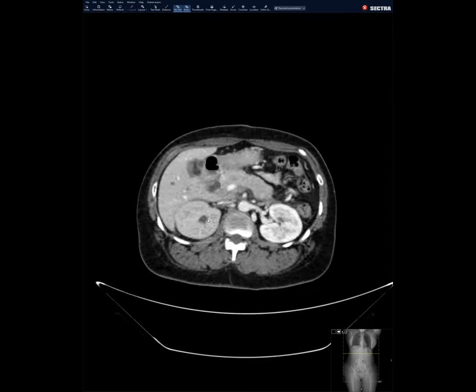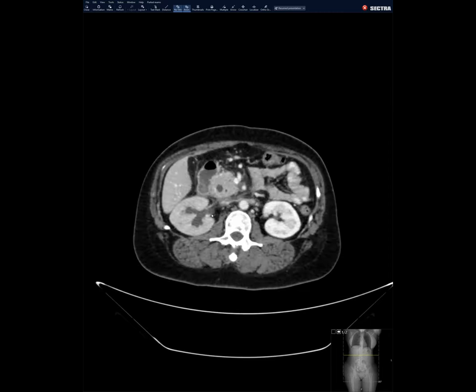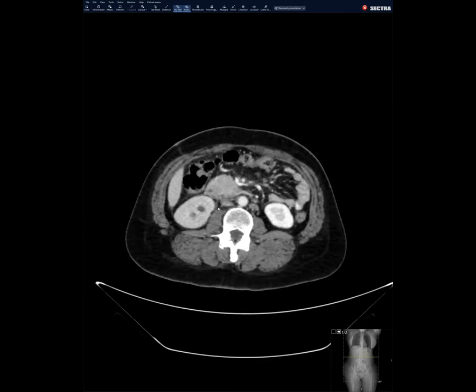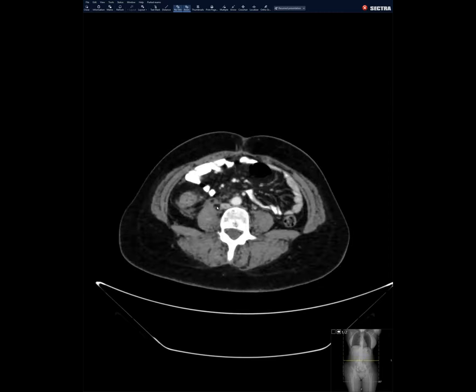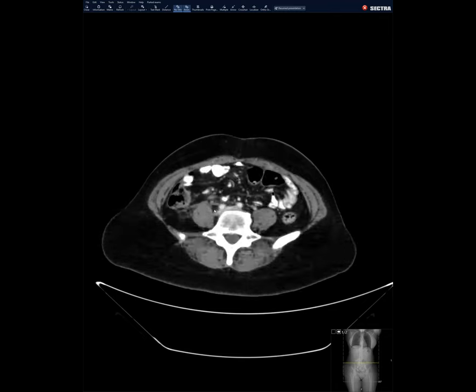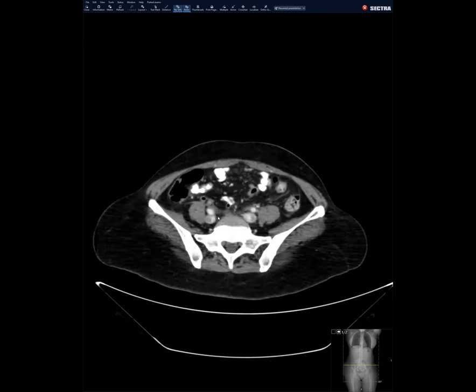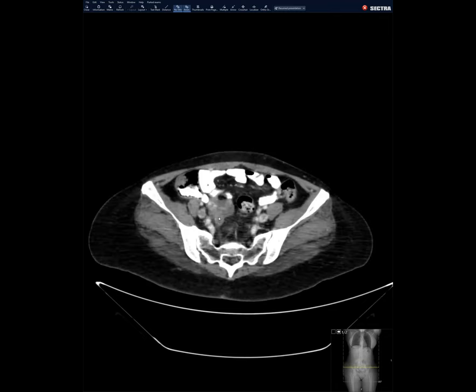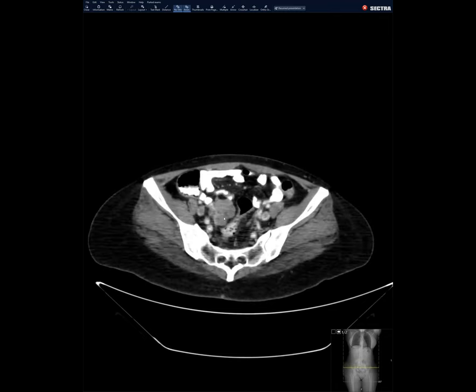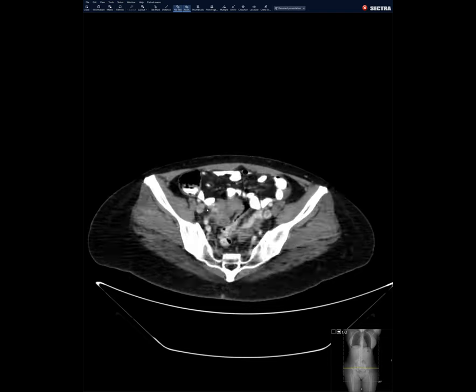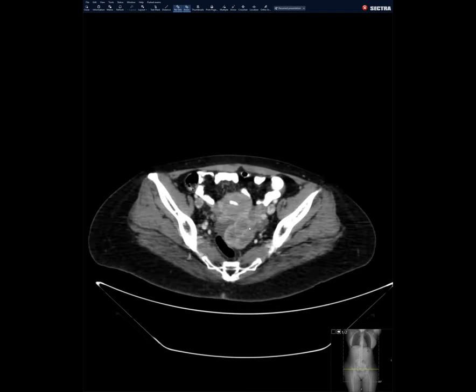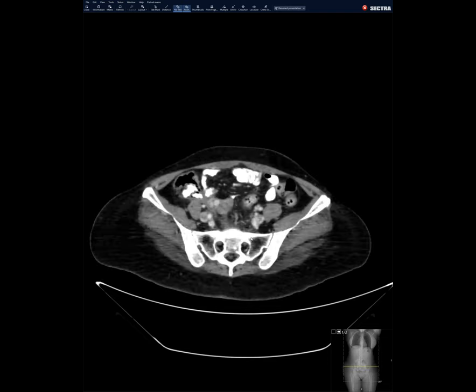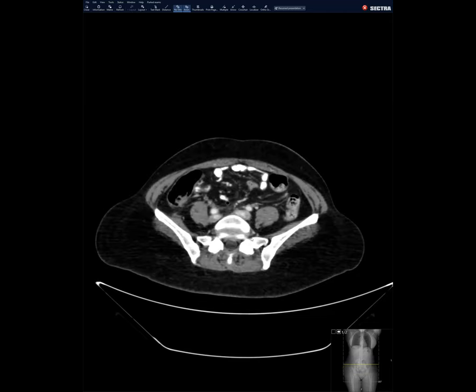And then what do we think of this hydronephrosis? We follow the ureter down and kind of lost it somewhere, which we presumed was because of these pelvic masses, probably arising from both ovaries.